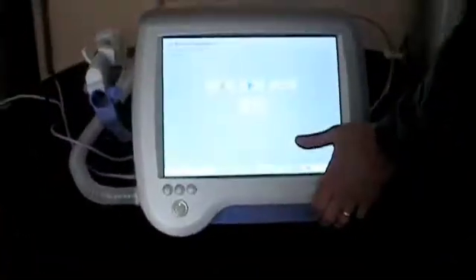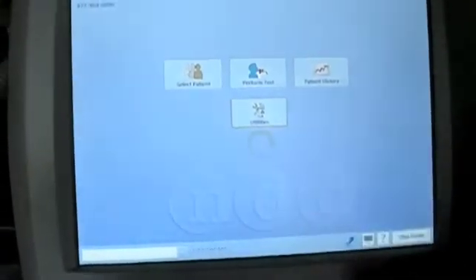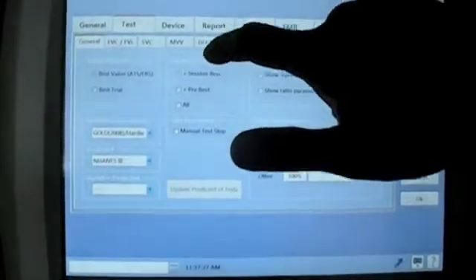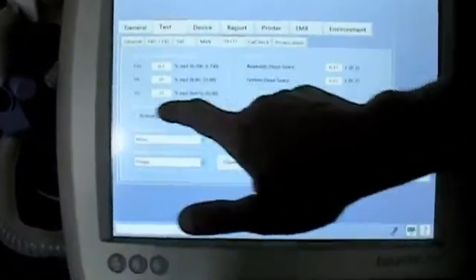Now we have to make the adjustment to the actual gas values in the instrument. We do this by pressing from the main menu: utilities, configuration, and then the test tab, and then DLCO because it's the gas. We're going to take the actual values on the bottle and input those into the test gas setting.